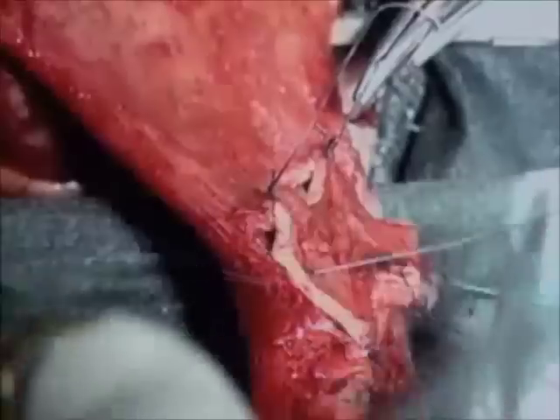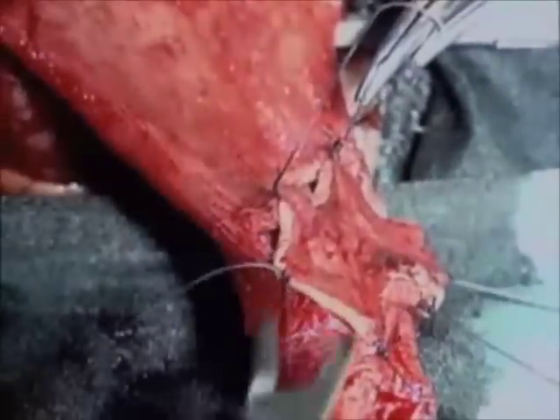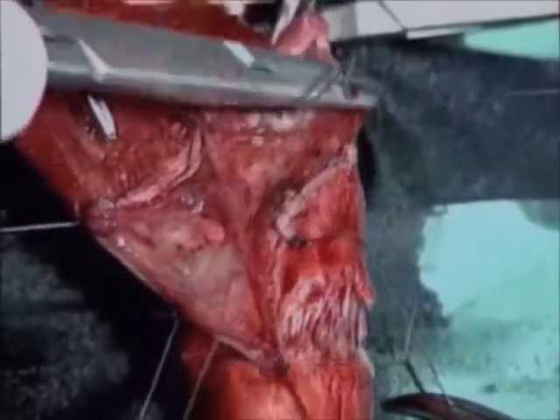Tunical defects are grafted using full-thickness penile skin previously taken. Grafts are anastomized using interrupted and running sutures.